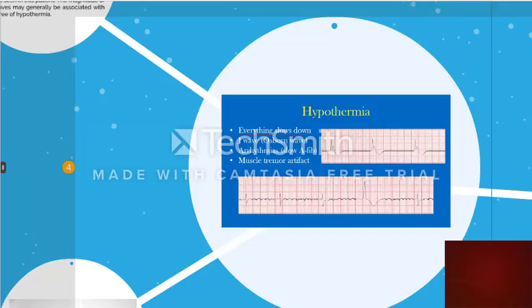Second, a distinctive and virtually diagnostic type of ST segment elevation can be seen. It consists of an abrupt ascent at the J point and then a sudden drop back to baseline. This is called a J wave or Osborn wave. So our second and most helpful finding is this J wave or Osborn wave, and we can see that here in this example on the top right. This is the Osborn wave, right?